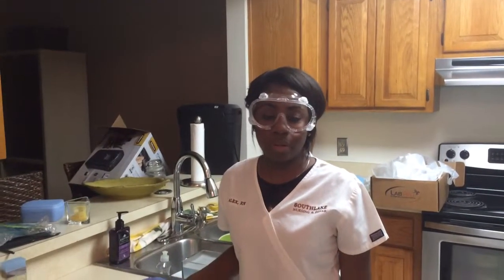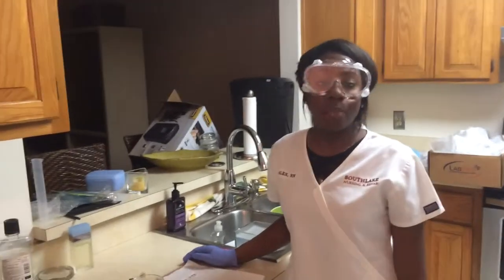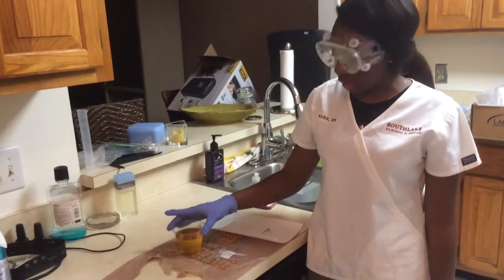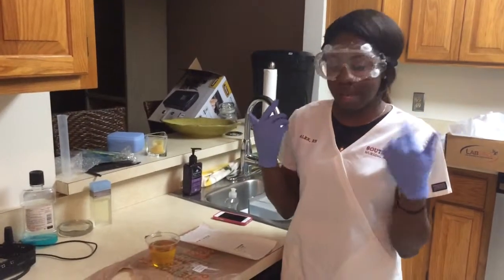Hi, my name is Alexandra Moore and I'll be doing the physical and chemical urine analysis of my urine. Prior to this lab I've already collected my urine via midstream and washed my hands, applied my gloves and glasses.